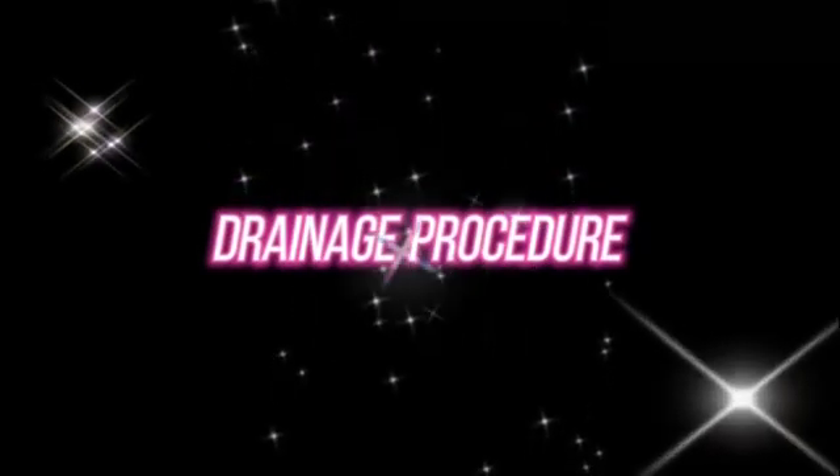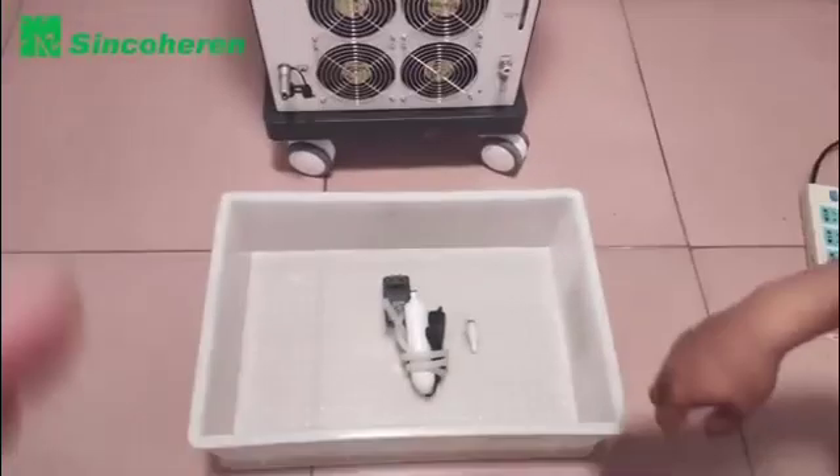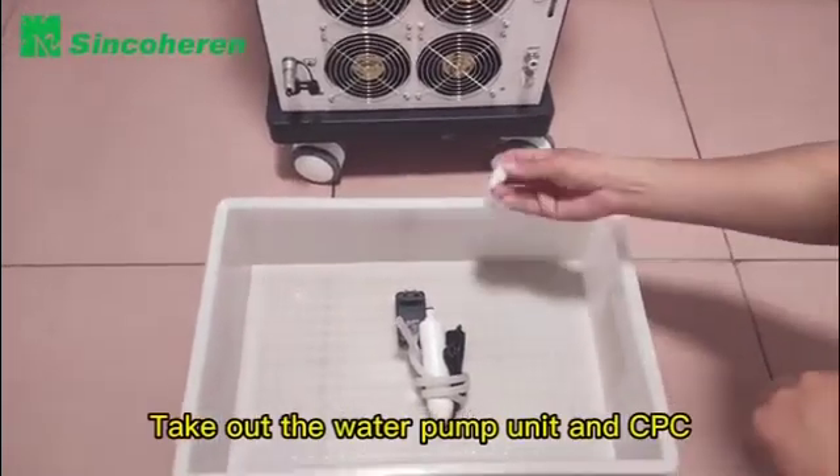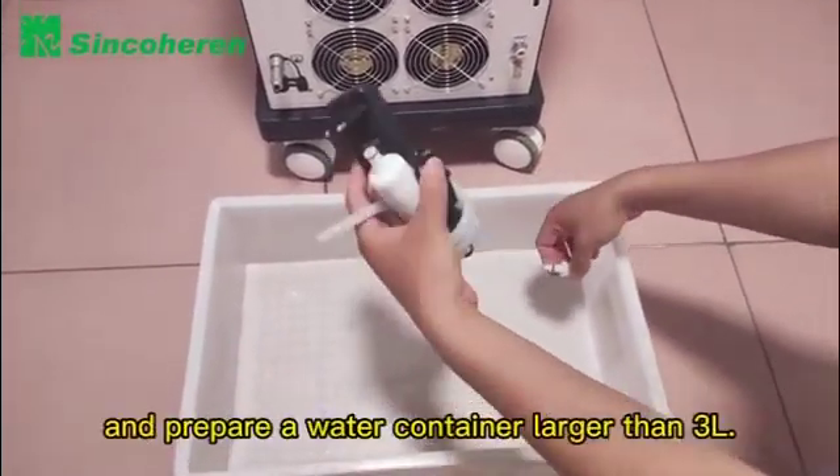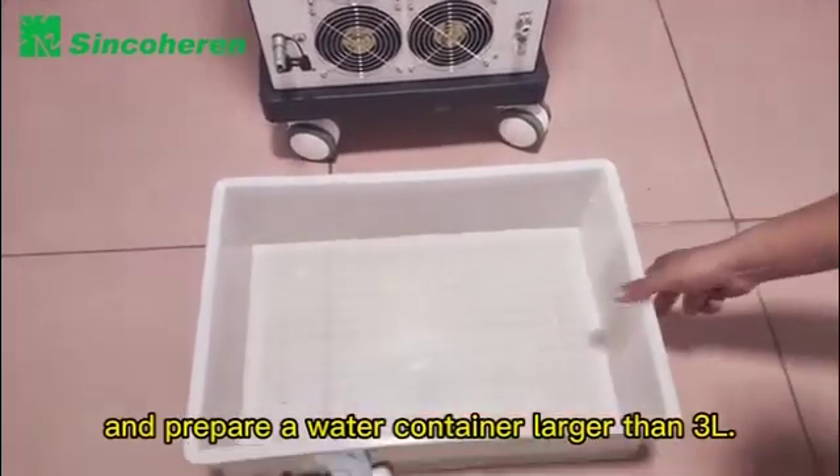Drainage Procedure. Take out the water pump unit and CPC plug from the accessory bag, and prepare a water container larger than 3L.